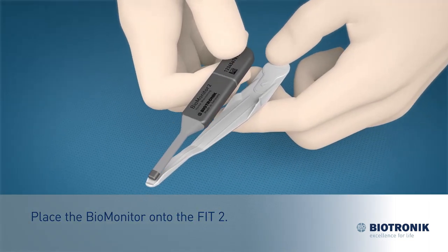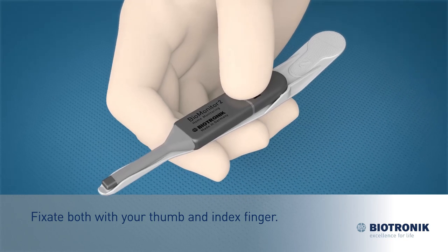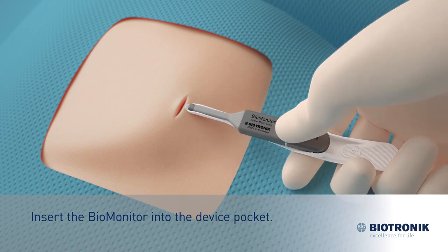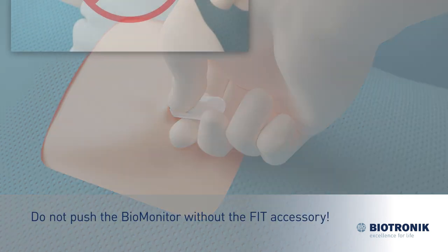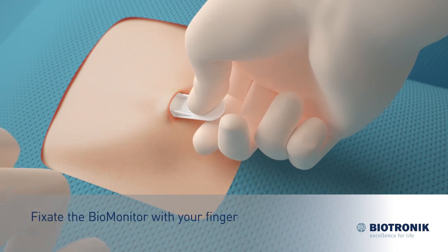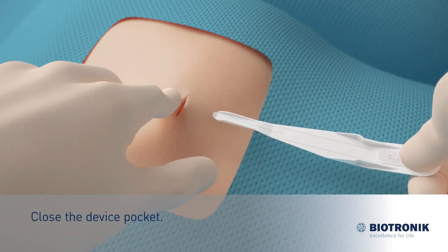Place the Biomonitor onto the FIT2 accessory. Fixate both with your thumb and index finger. Insert the Biomonitor with the FIT2 accessory into the device pocket. Put your thumb on the protruding end of the Biomonitor to insert it completely. Do not push the Biomonitor without the FIT accessory. Fixate the Biomonitor with your finger and remove the insertion tool from the pocket. Close the device pocket.